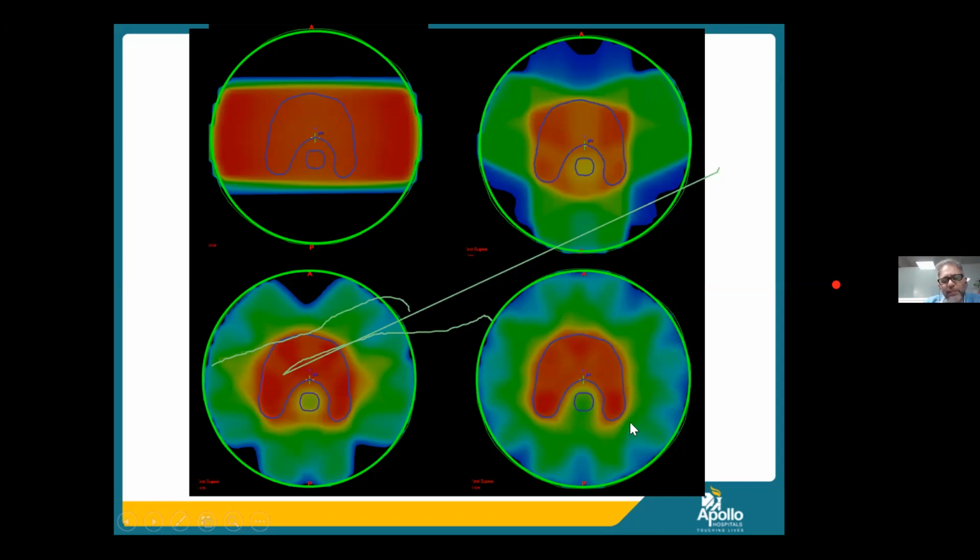So if you compare like this, although there is a high dose envelope to the tumor, and also to the surrounding tissues, a thick slab of normal tissue, you are sculpting the dose to the surrounding structures, but you actually distribute this heavy or high intensity dose as a low or intermediate dose wash to a significant amount of normal tissue. In radiation oncology, we call it integral dose. So this was one of the questions: with even the highest form of photon therapy, the integral dose is relatively high.